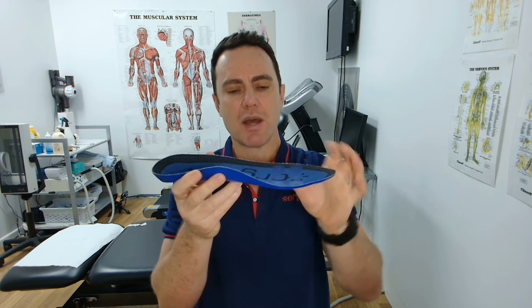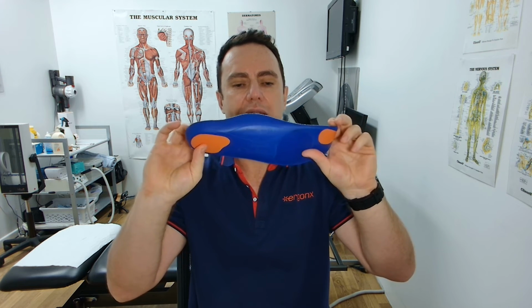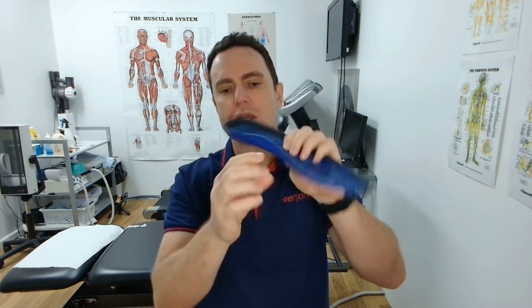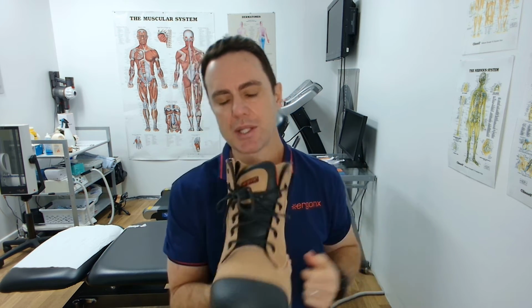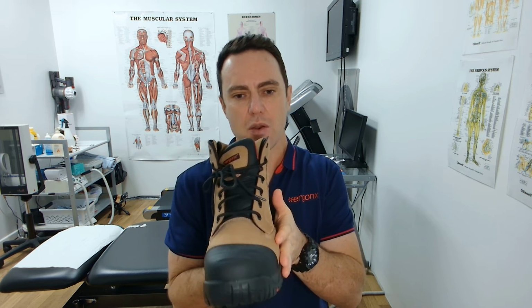It'll also have enough depth so you won't crush your foot, and there's also enough room in the heel height. This is what Paul was concerned about: is there going to be enough room in the heel? Once we remove our orthotic insole, you can see it's broadly the same shape as a custom-made orthotic. The podiatrist will remove this insole and put Paul's custom-made orthotic into the boot, and that will help to give him a much more supportive boot than if we didn't put anything in there at all.